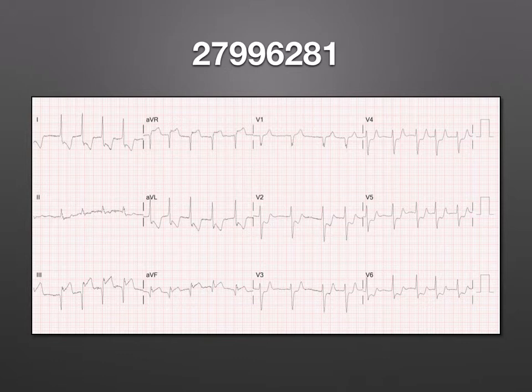What do you suppose happens if you have a sudden onset of a proximal left main occlusion? Well, you're probably going to have some pretty nasty chest pain, and then you're likely to go into cardiac arrest, which is exactly what happened. Now, here's the interesting thing. With this patient, we appropriately did CPR, we managed him, we defibrillated him back into this rhythm. Now, this was a patient from Marble Falls, and they're not particularly close to any STEMI receiving centers. So they had time to do an additional ECG.